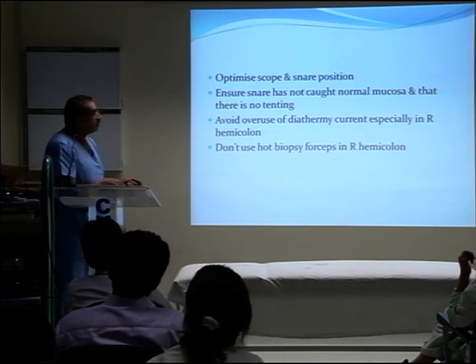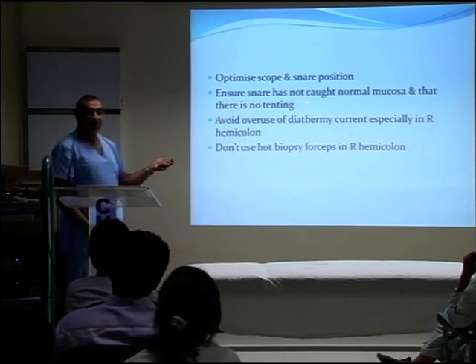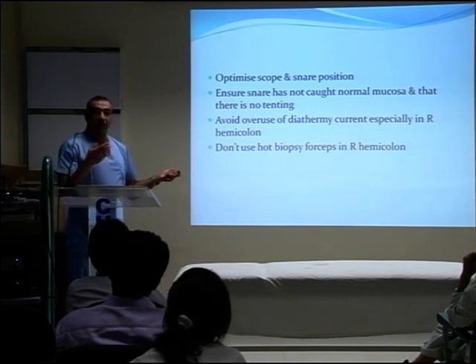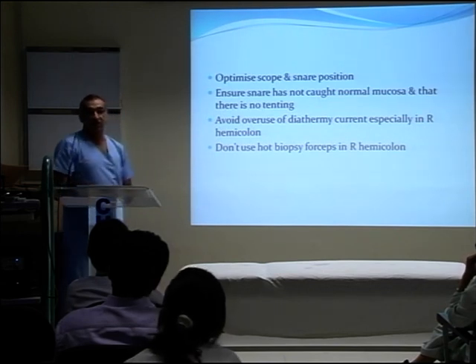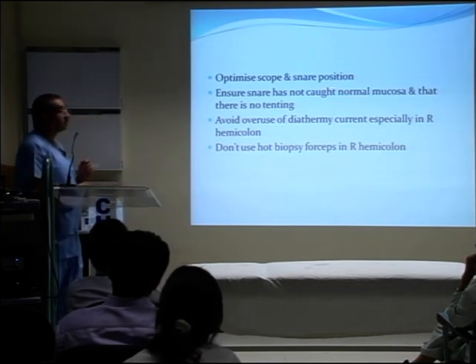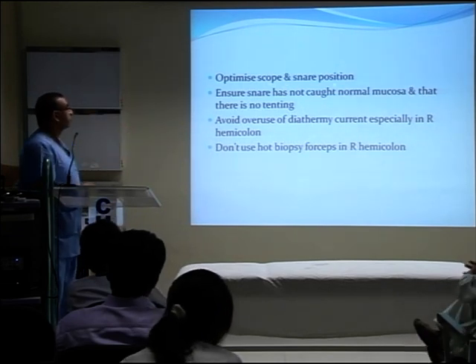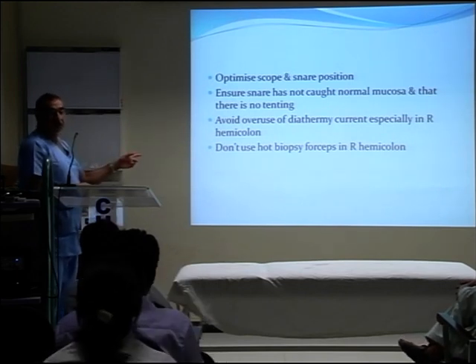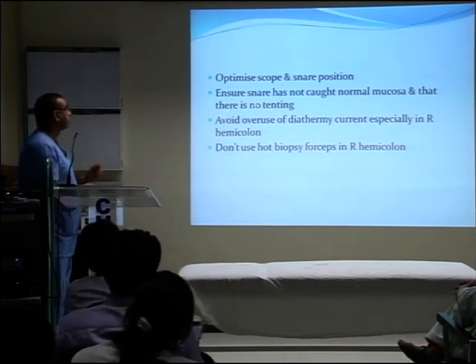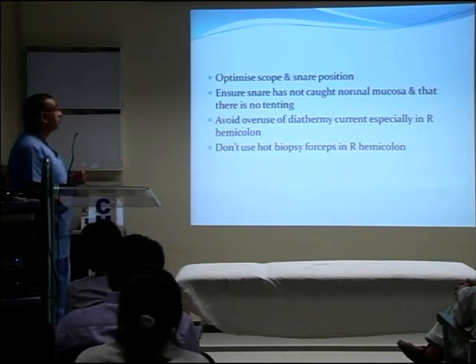Because the problem is, you might catch it from an awkward position, but in case anything goes wrong, you cause a perforation or you cause a bleed, then you won't be able to get to it. So always be in the most comfortable position, so optimize your position. That cannot be overstressed, because that is the most important thing. Not just for the procedure, but even for the occurring complications, right? So anything. And the other thing is, make sure that your snare has not caught normal mucosa.